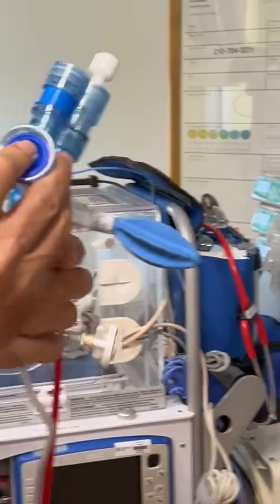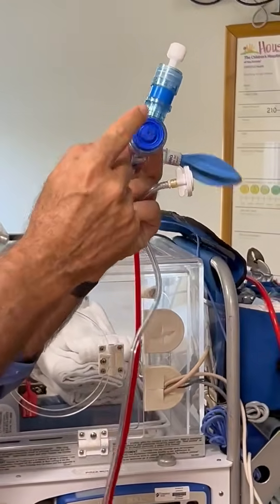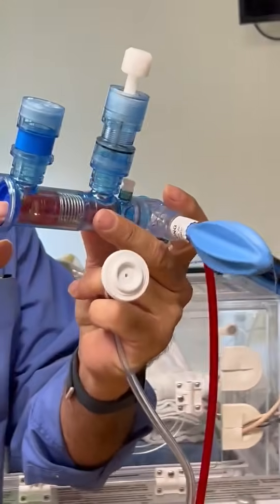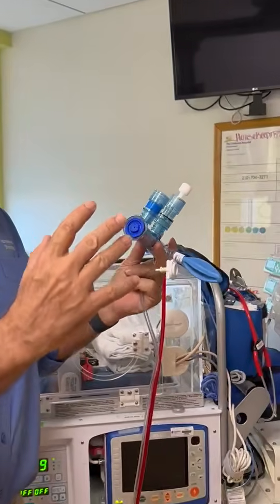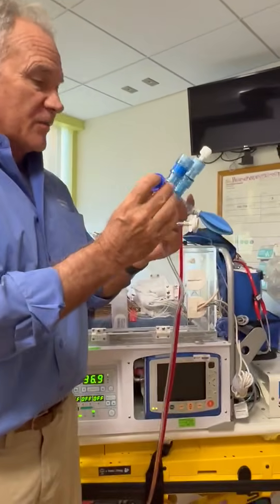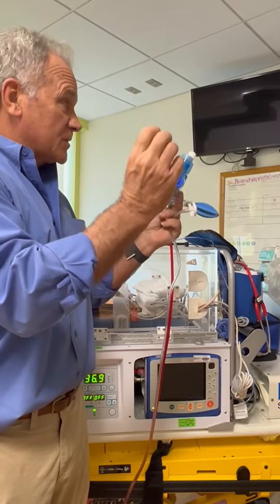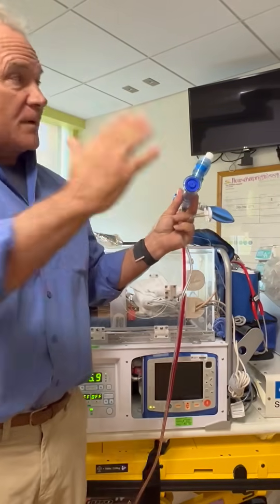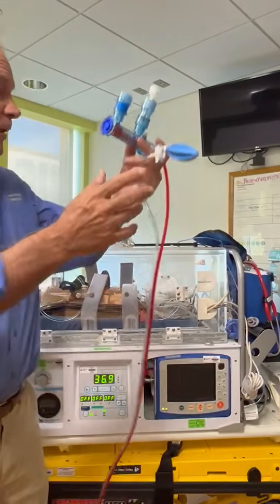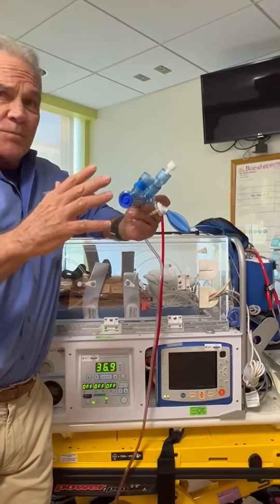And then I said it had passive exhalation, right? But it actually has active exhalation, but it's not much. So basically the way the flow interrupter works, it delivers a breath, it stops, and then the spring lets go. So, inspiratory time and then exhalation. So that's why we typically slow down the rate. And we'll talk in more detail later about what y'all do, but I think y'all go based on disease processes here.